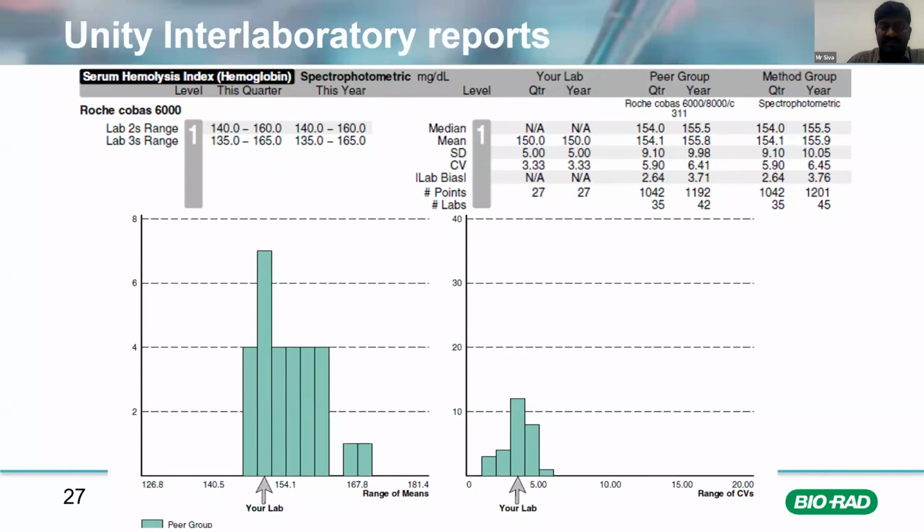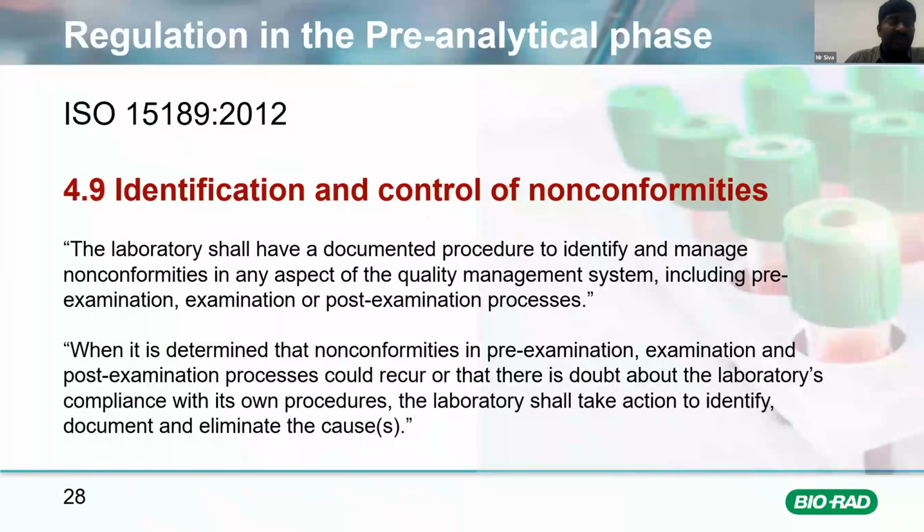And also the CV percentages, how much your CV percentage is among the other laboratories. Are you with the majority of the people, or are you better than them? You can definitely look at this report. And of course, we have other recommendations and instructions for using IQC and EQAS, etc.